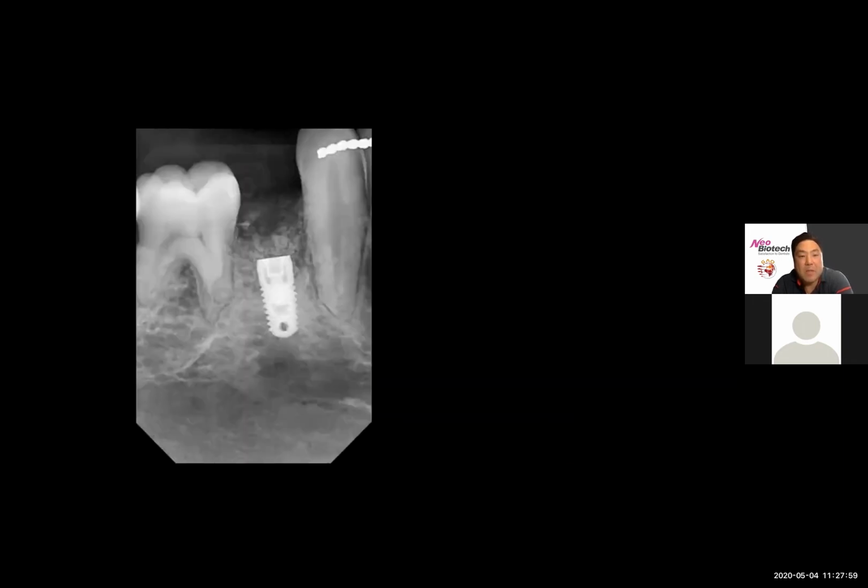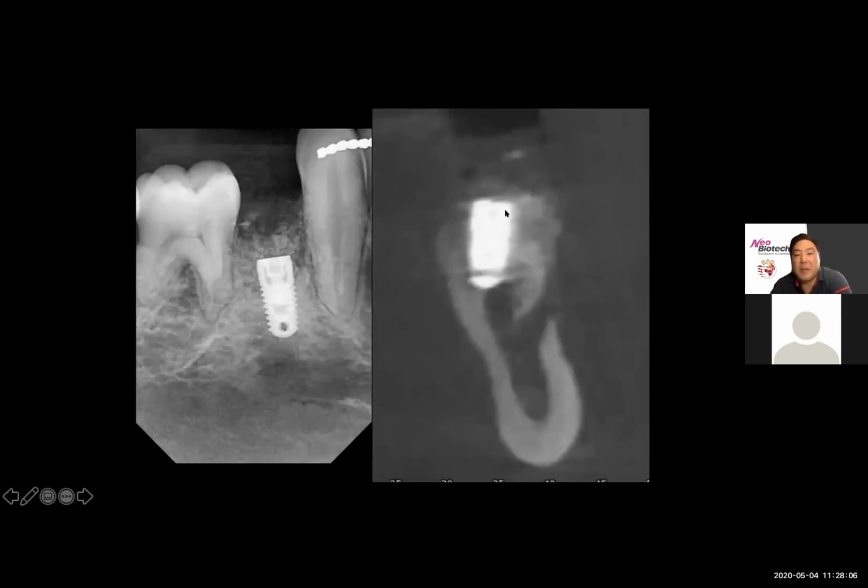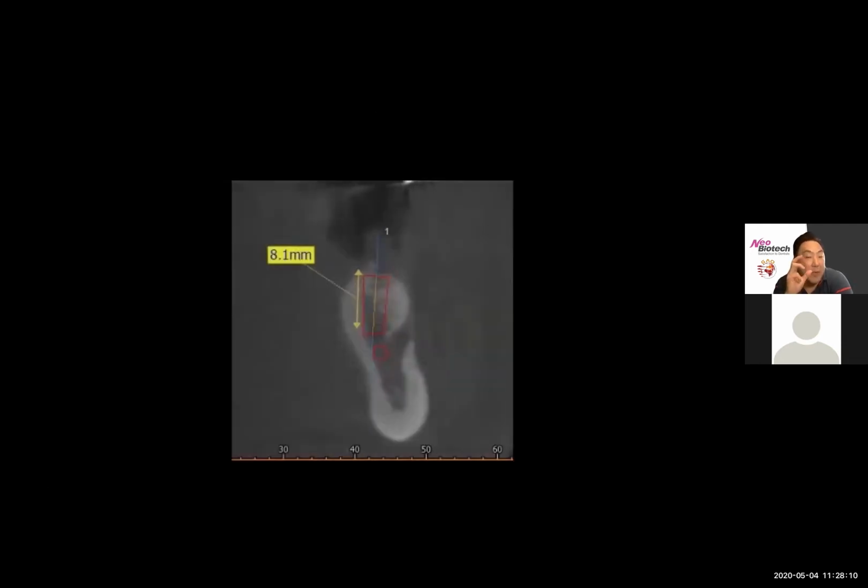And then here's my implant position. You can see the bone graft that was placed over and about the implant. So with proper planning, we can ensure that we have our implant fixture placed in the correct position, placed within the alveolar housing in a correct restorative position. So we took all this information before we did our surgical procedure, so that we understand where we want our implant to be, provided that we have the alveolar hard tissue support.